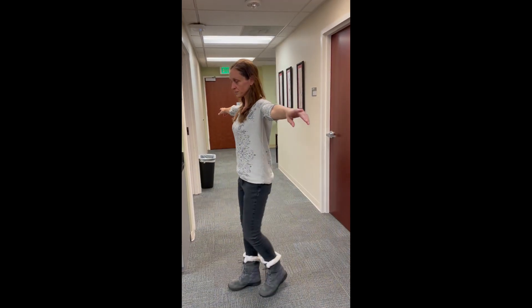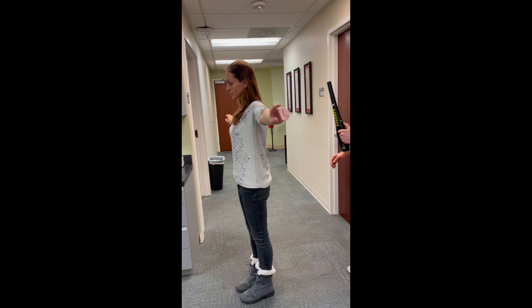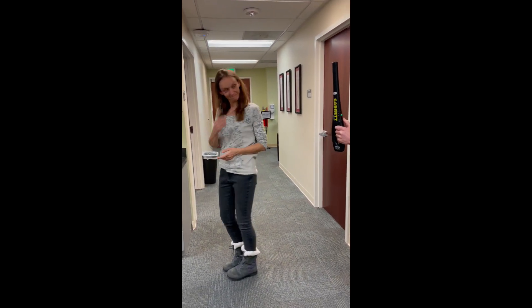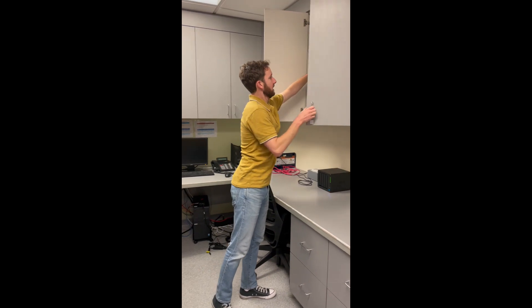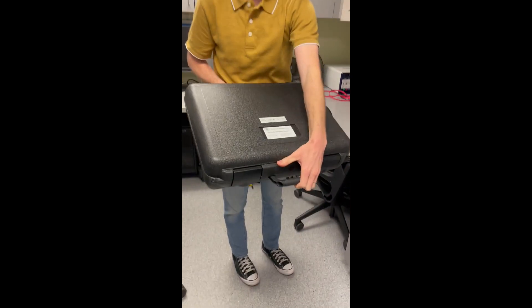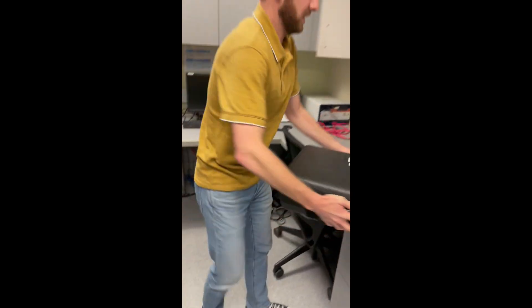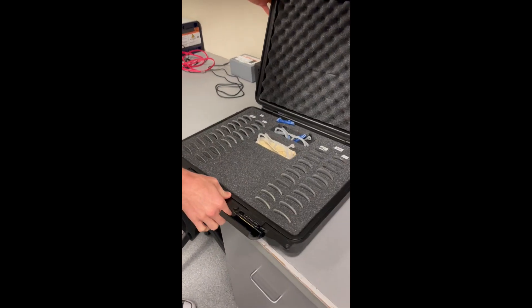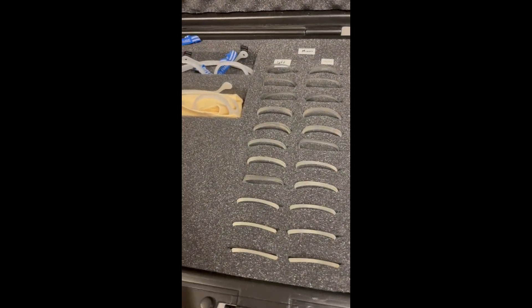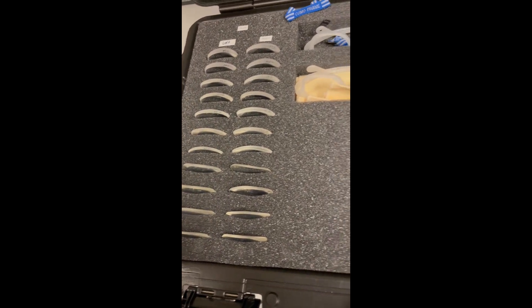Now we'll go behind. Do you have something in your back pocket? I'll keep going and finish up. Most corrective lenses and glasses are not safe to go into the magnet room, so we have our own pair of corrective lenses here in the cabinet, labeled as vision correction lenses. If needed, go ahead and find out your participant's prescription — we have various types. Outfit these on your participant if they are in need of corrective lenses.